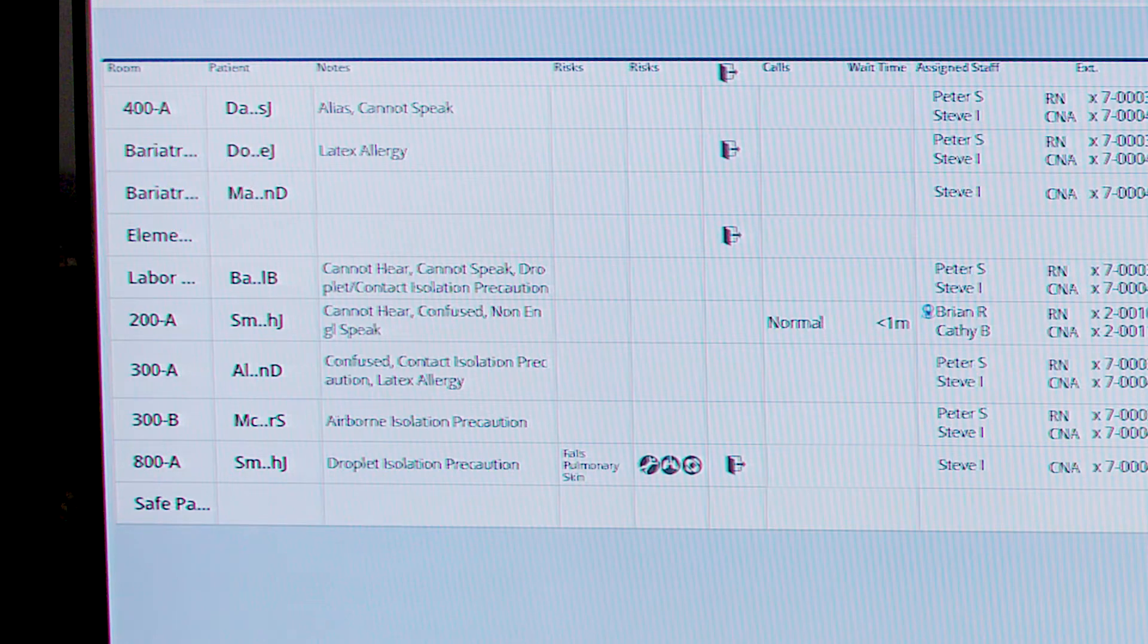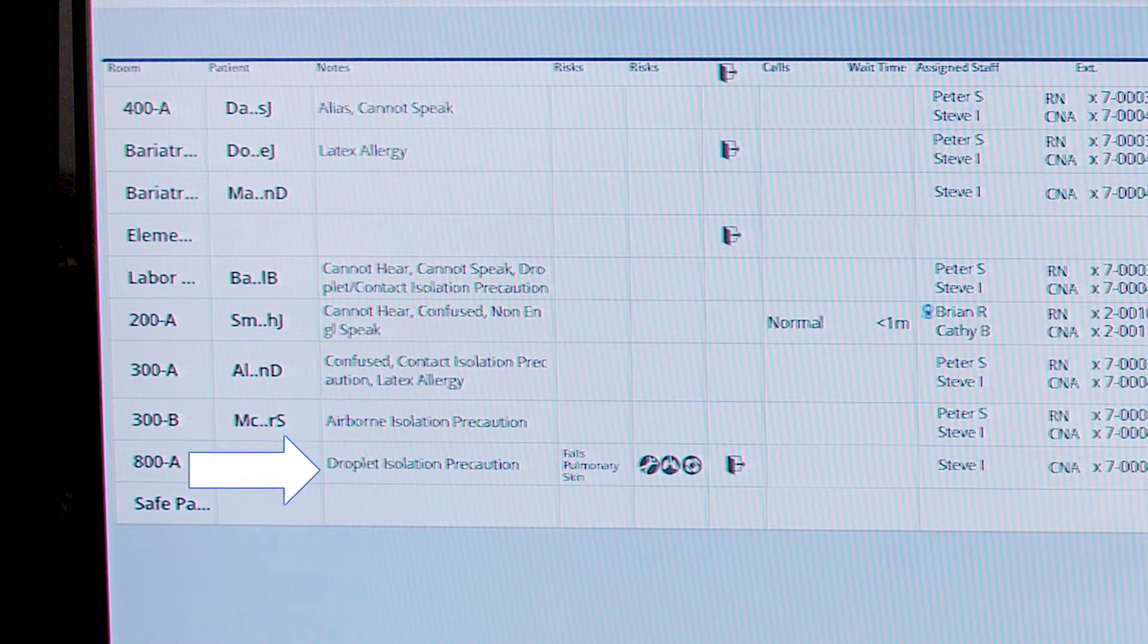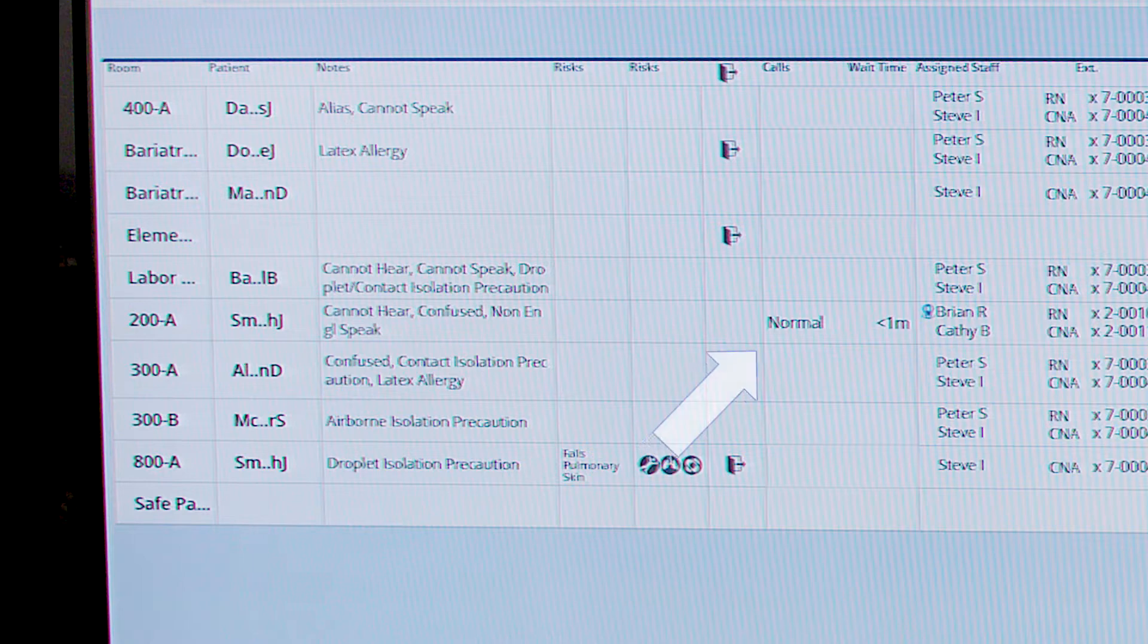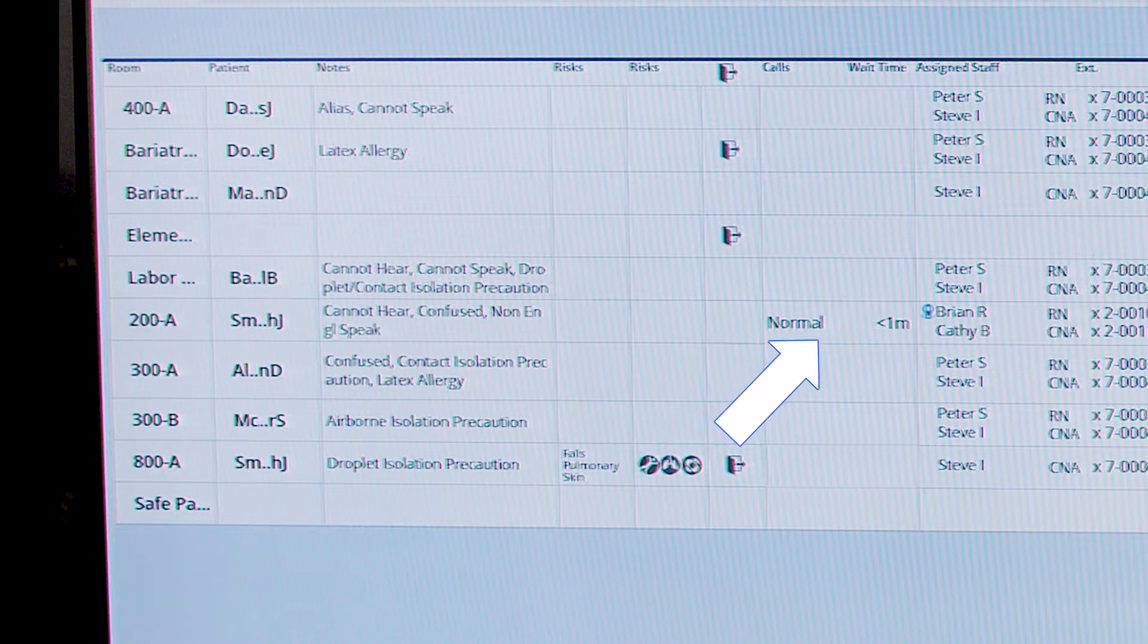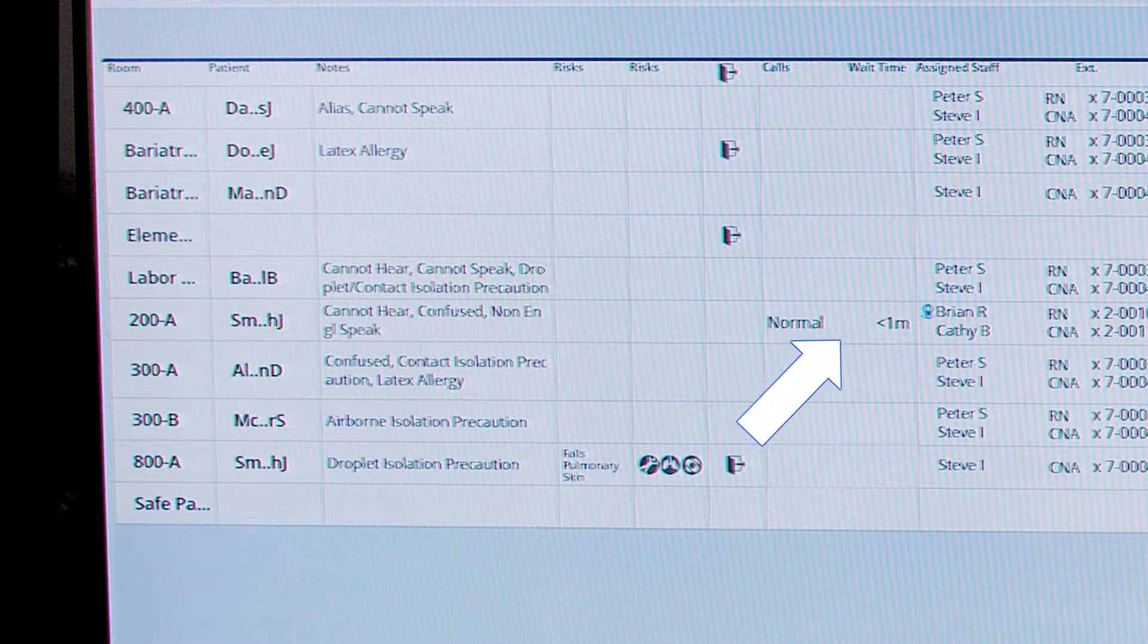We may see visibility to patient notes as well as any risk indicators that the patient may experience. We're also going to have visibility to any calls that are currently active in the patient room environment, as well as visibility to the wait time of that particular call.